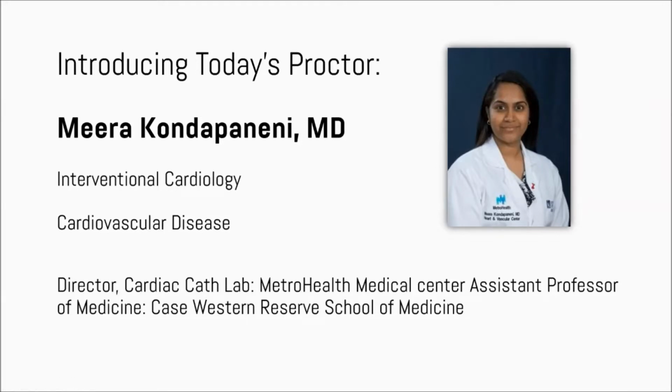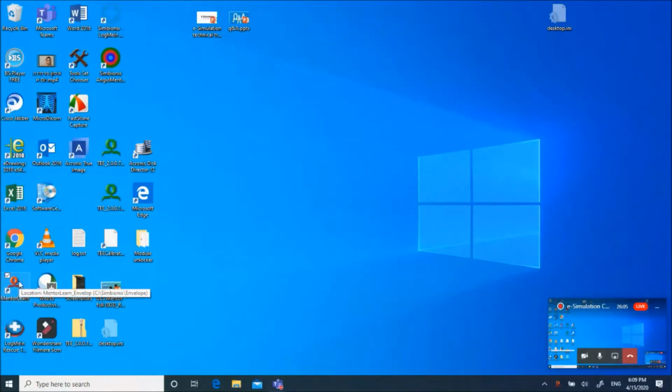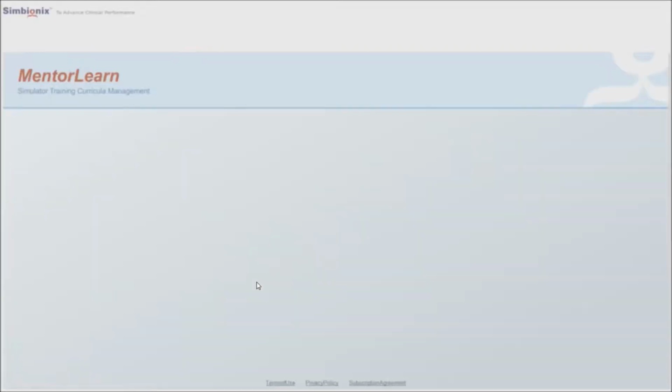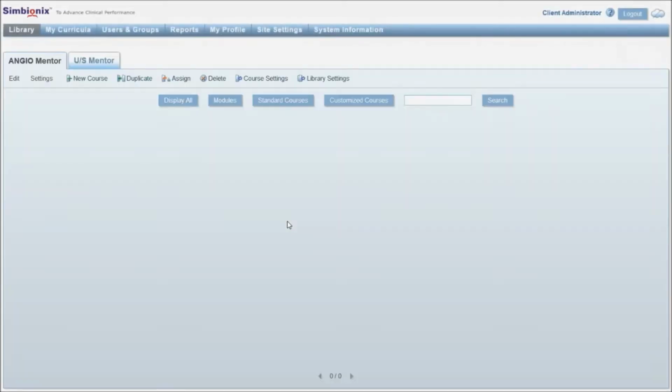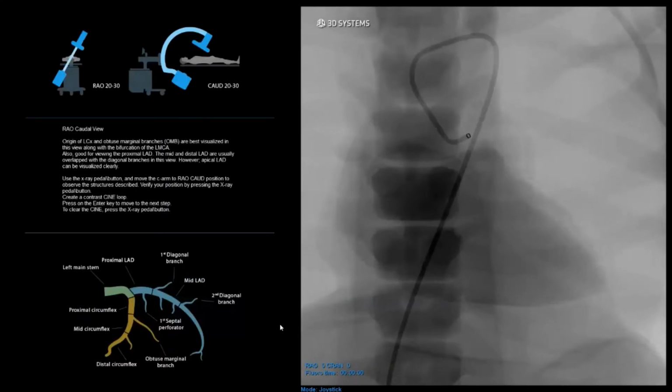Thank you, Shani. Welcome, everyone. As Shani is going to go through the module, I'll try and guide you through the basics of coronary anatomy. If there are any questions, you can post them on the Q&A and Shani will forward those questions to me and I should be able to answer you as much as possible in real time. But we will be more than happy to answer at the end of the session as well. All right, okay. Go ahead, Shani.